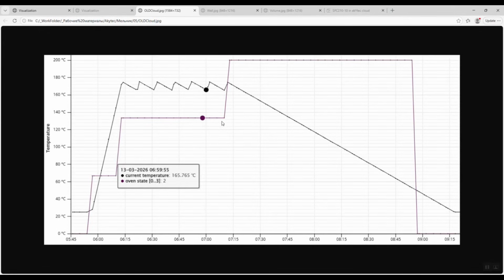Let's take a look at the old temperature change graph inside the sterilizer chamber. As you can see from the graph, the cloud service draws straight lines during all phases of the sterilizer's operation: heating, holding temperature, and cooling. In other words, in all phases, we see an absolutely linear relationship between temperature and time, since our emulator algorithm increases and decreases the temperature at a constant rate.